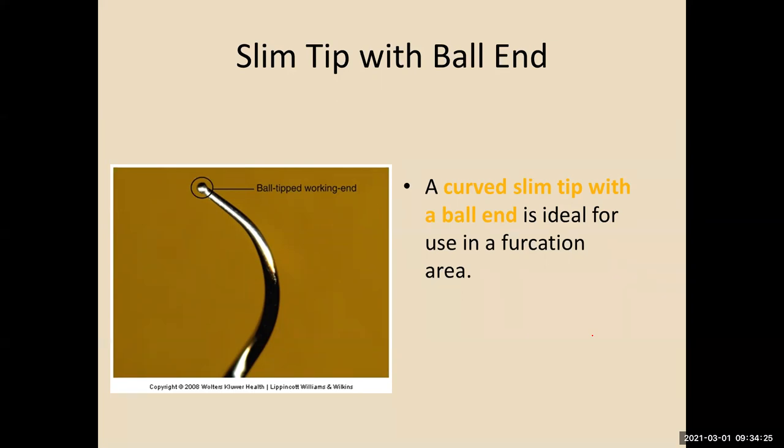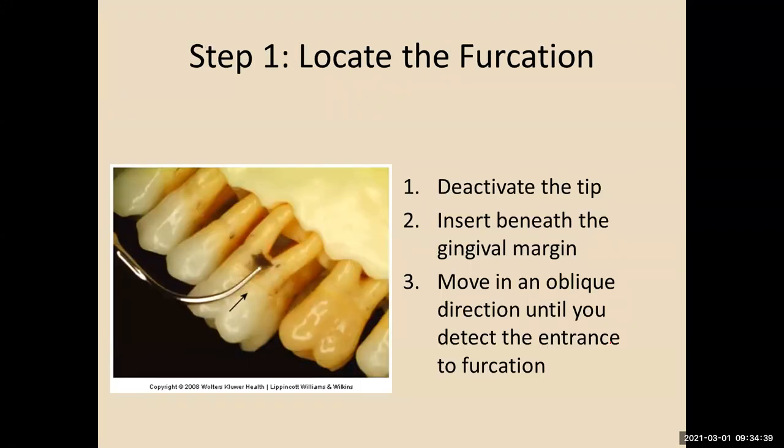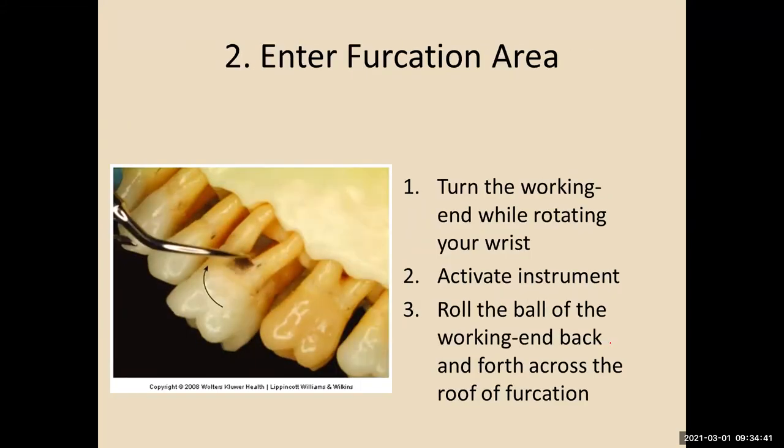These balls are great for furcations. You can't get a hand instrument into that furcation. Can't get it. This is curved to go into the furcation.